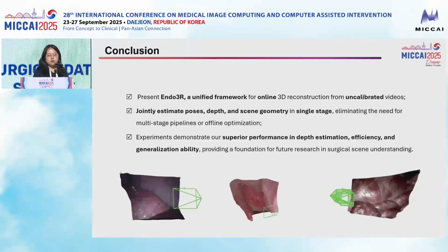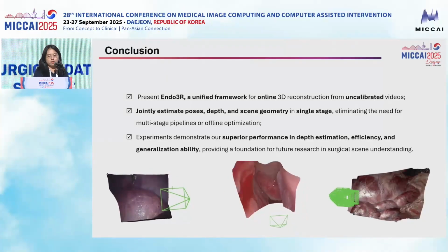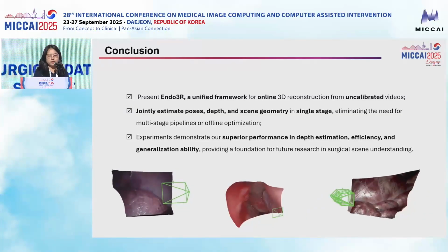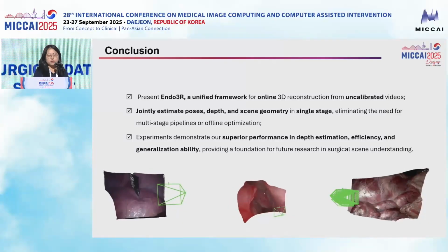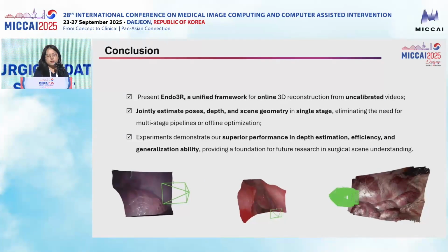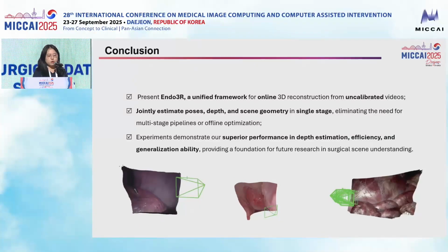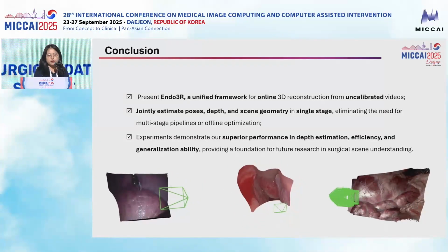So in conclusion, we present Endo3R as a unified framework for online 3D reconstruction from uncalibrated videos. And our method could jointly estimate pose, depths, and scene geometry in a single stage without any multi-stage pipelines or offline optimization. And our experiments also show our superior performance in depth estimation, efficiency, geometry, and generalization ability, and it also provides a foundation for our future research in surgical scene understanding.